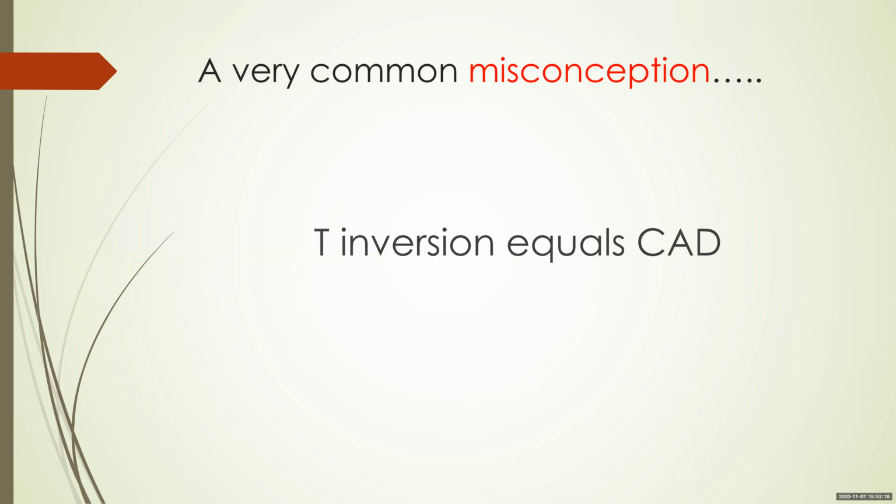So, a very common misconception: T-wave inversion equals CAD. T-wave inversion may be equal to CAD, but we are not very sure in a given case. It can be a normal variant. It can be a non-cardiac condition. It can be a non-CAD cardiac condition. And finally, CAD. Use your clinical judgment.